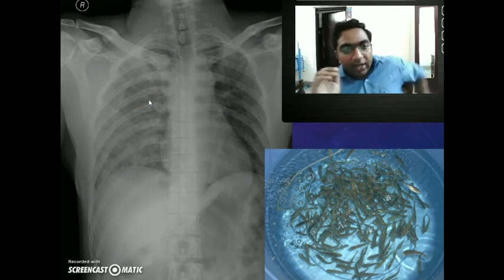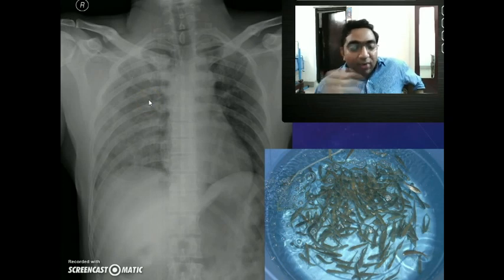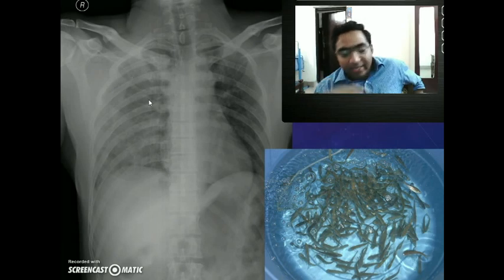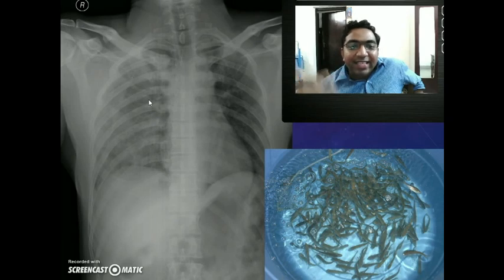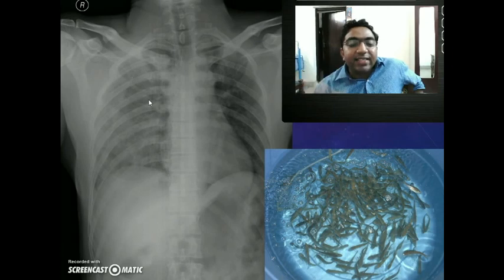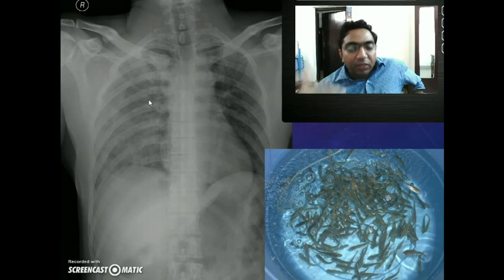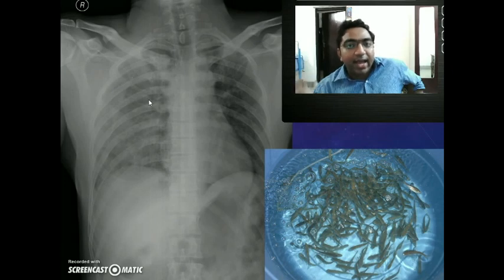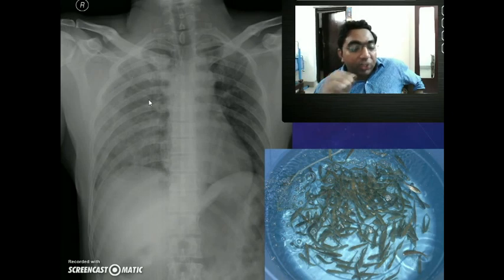In clinical practice, if we have only X-ray and the patient cannot be mobilized or is on a ventilator, we can take serial X-rays and see whether the haziness is increasing. If the haziness is increasing, there is continuous bleeding and we can decide to put an intercostal drainage tube. That is how serial supine X-rays can help us make decisions regarding intercostal drainage in case of hemothorax.